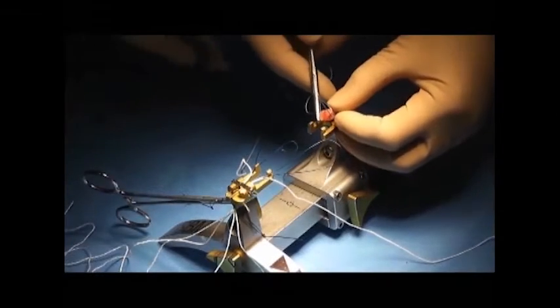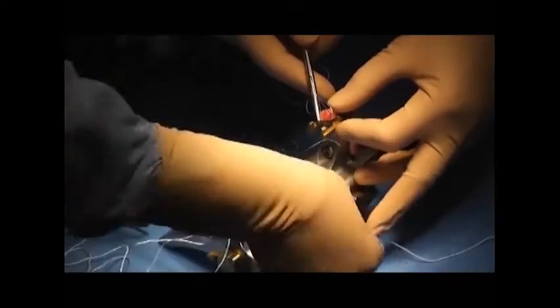Pass a needled suture loop through the bone block. Pass one end of the white braid sutures through the suture loop. Pull on the needle until the white braid passes through the bone block and thus through the graft.